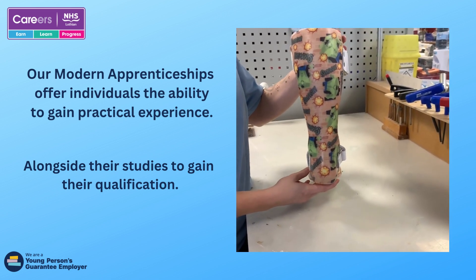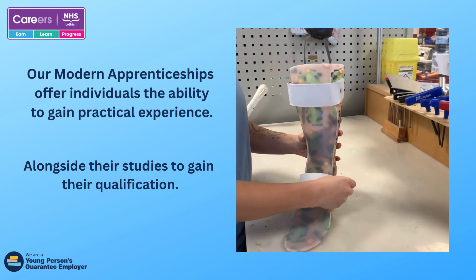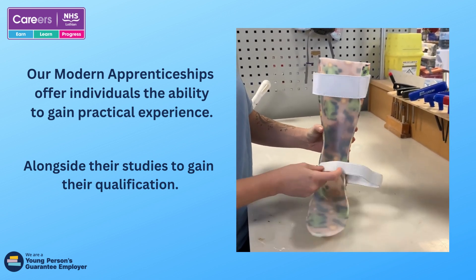This is an example of something I've recently made. This is an AFO. AFOs are used to support the patient's ankle and to help them walk.